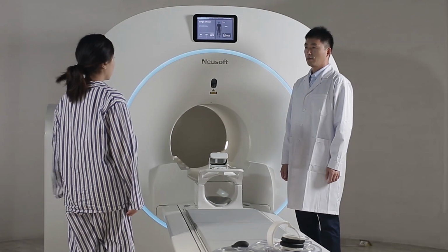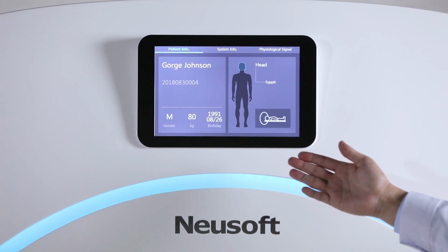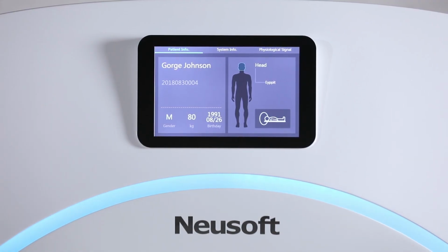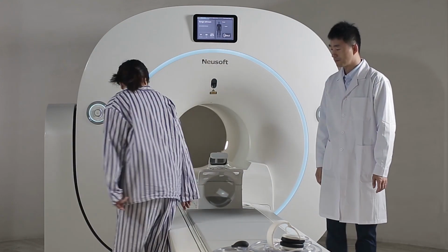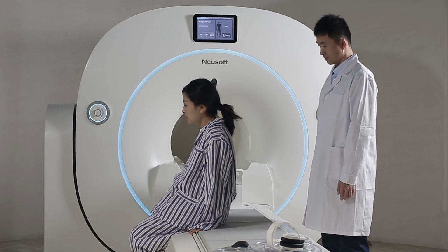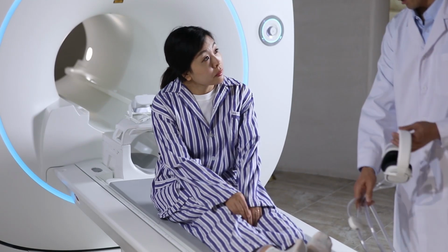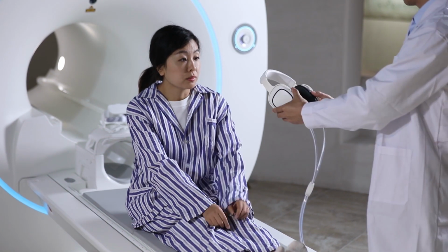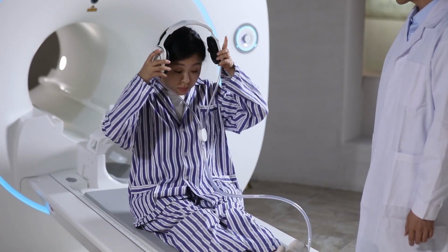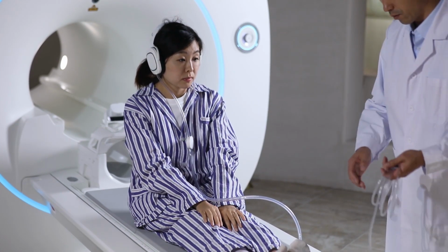After entering the scan room, select the 24-channel NV coil. Check and confirm the name, gender, age, scan parts, and other information of the patient on the LCD display. The patient should wear non-magnetic soundproof earphones and hold the alarm ball in one hand. Advise the patient that the scan may take a long time and there may be noise, and ask the patient to stay still during the scanning process. If there is any discomfort, press the alarm ball.